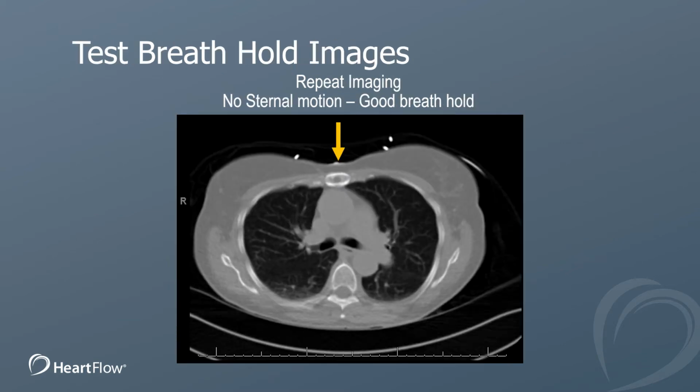This is the same patient re-imaged and re-coached to hold their breath appropriately. You can see now this time when this was caught that they didn't understand how to hold their breath, and we coached them again, and now they have no sternal motion, and this is a good breath hold.